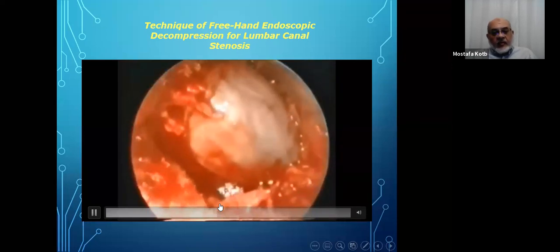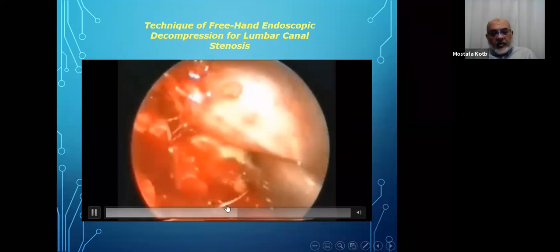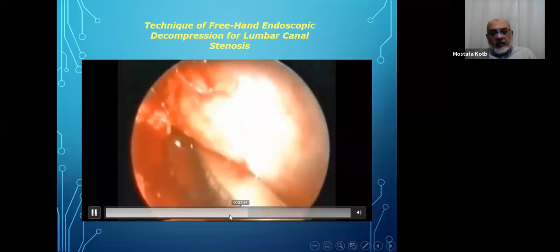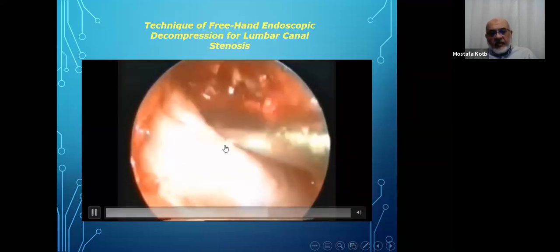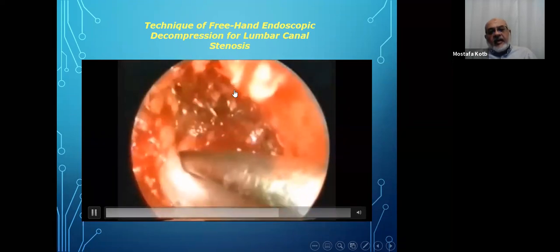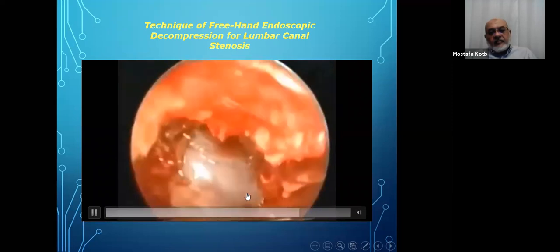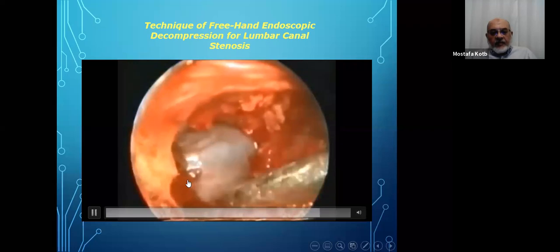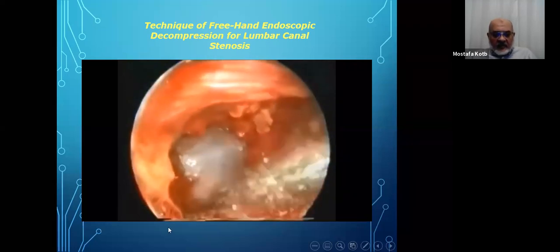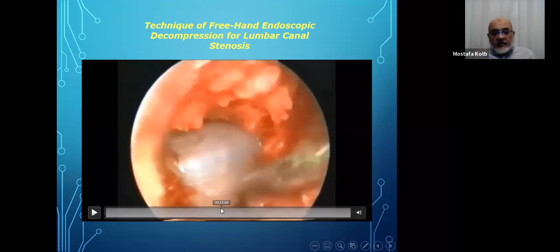Then I go to the ipsilateral side to expose the nerve root on both sides of the exposure, creating a big cavity dorsal to the theca in here to eventually end up with a decompressed, fully relaxed theca, as you can see.